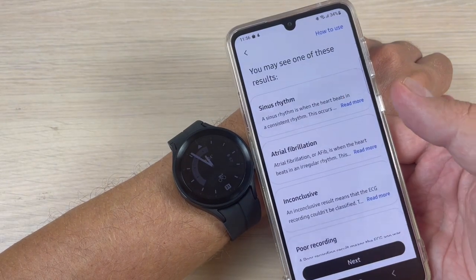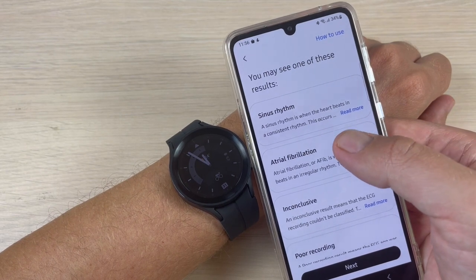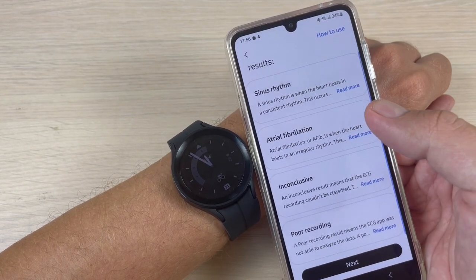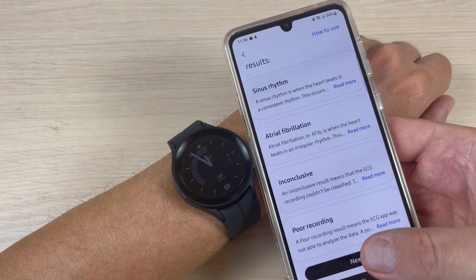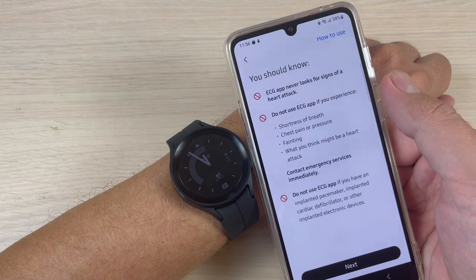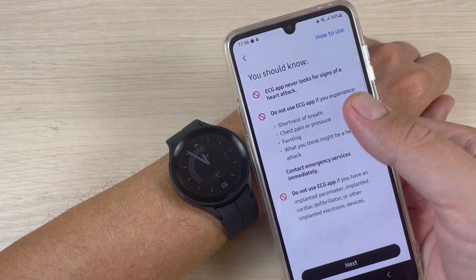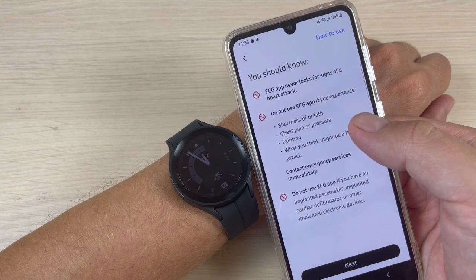Now just press 'Next'. You may see one of these results: sinus rhythm, atrial fibrillation, inconclusive, or poor recording. Now press 'Next'. You should know that the ECG app never looks for signs of heart attack.